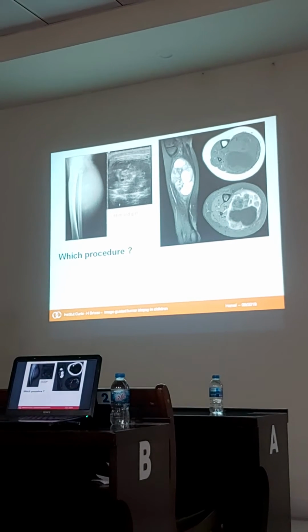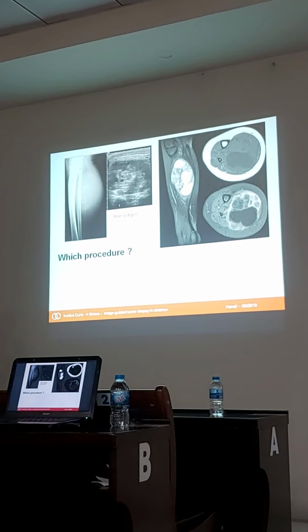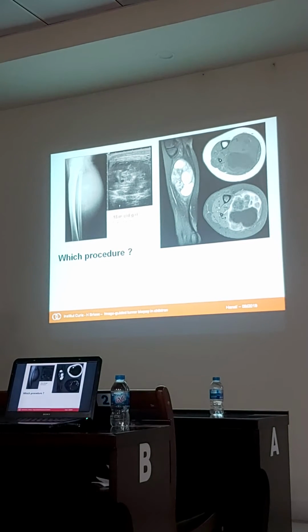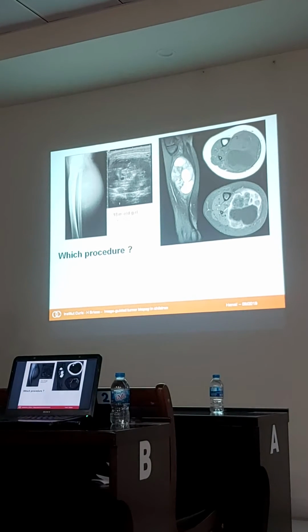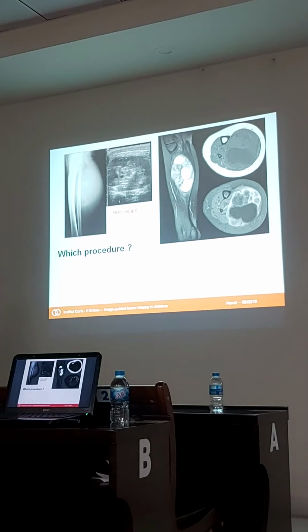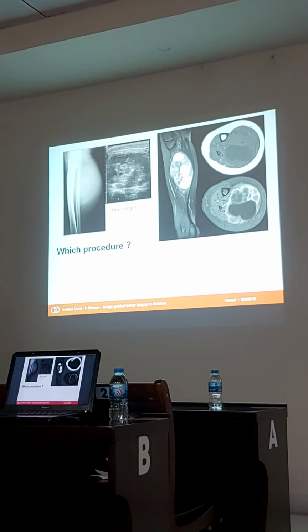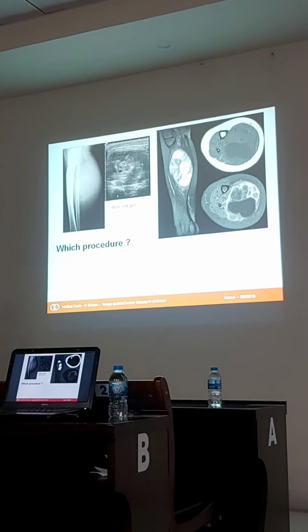In this situation, it's a typical soft tissue mass. It's a very large and necrotic tumor of the leg. So it's probably a sarcoma. The most frequent sarcomas in children are rhabdomyosarcomas. So you have to perform a biopsy for this.